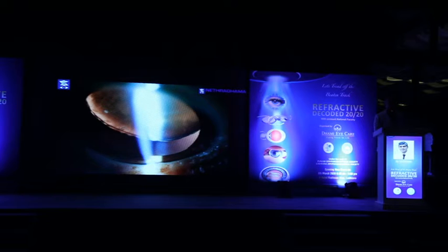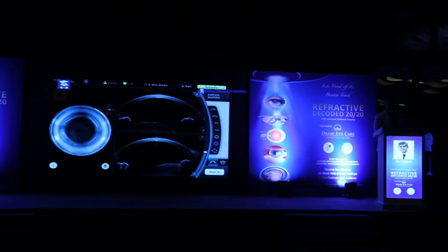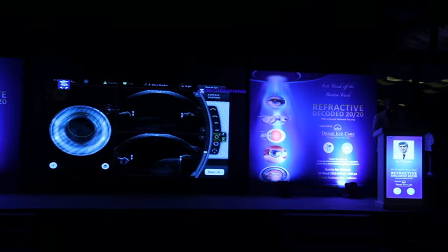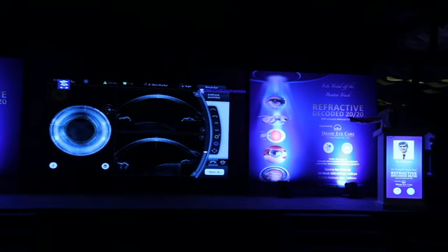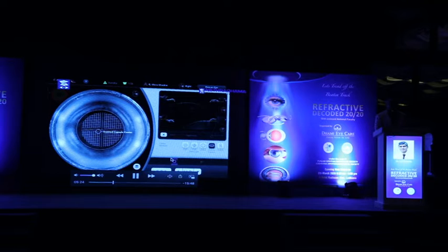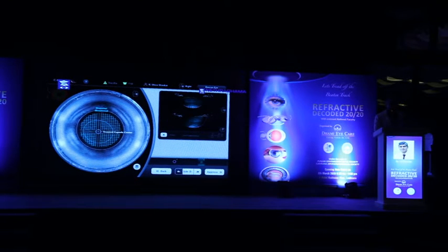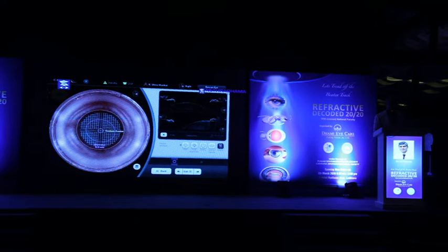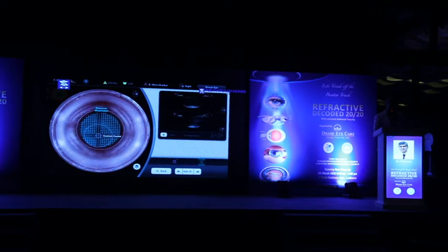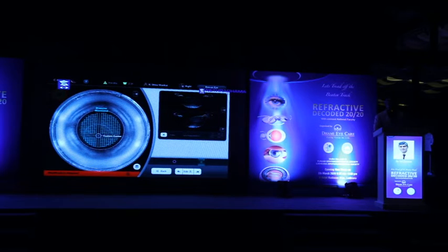Is femtolaser useful? This was a patient with a traumatic subluxated cataract after shuttlecock injury. The OCT on the femto shows significant tilt of the lens with a large gap. To address this, you have to offset the capsule center using custom centration, offsetting it so it is centered to the capsular bag.